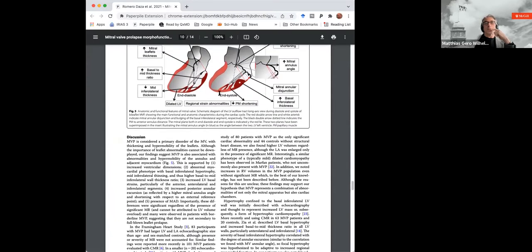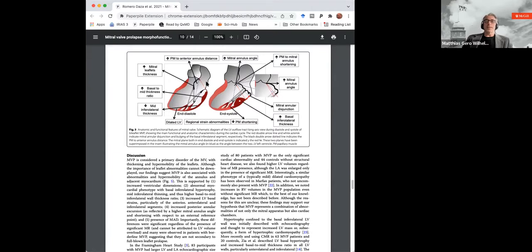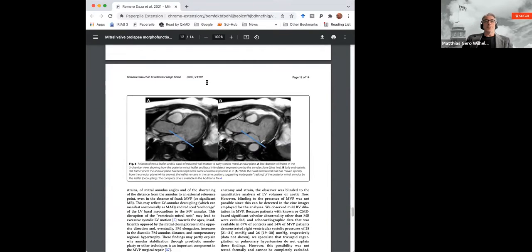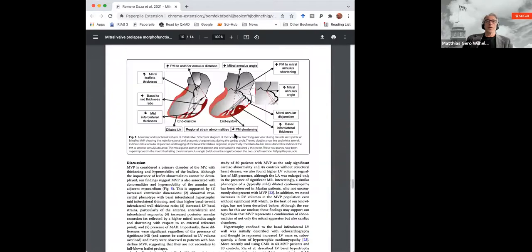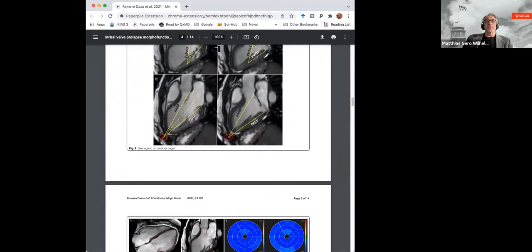And so mitral valve prolapse should not be just seen as a disease with just a thicker mitral valve and basically floppy leaflets, but also as a problem of the geometric setup of the left ventricle in a three-dimensional space. That also refers to the motion of the entire plane. And what I do actually in clinical routine in the 4-chamber view, and I think I saw that here in one of the first two in the systolic, yeah.